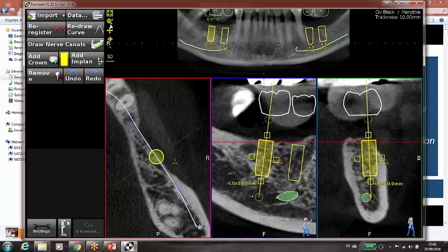Basically, if I now get closer to the Micron Tracker with the jaw tag and drill tag, the system acknowledges the tags and allows me to start working with the crosshair, which allows me to place the implant dynamically. So this is the end of the planning session.